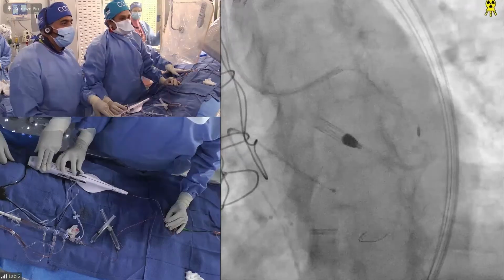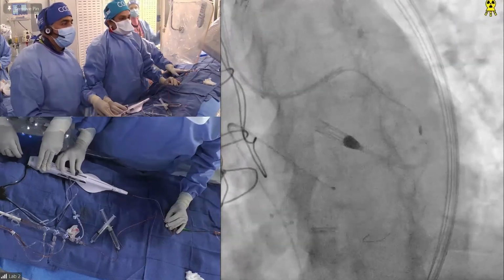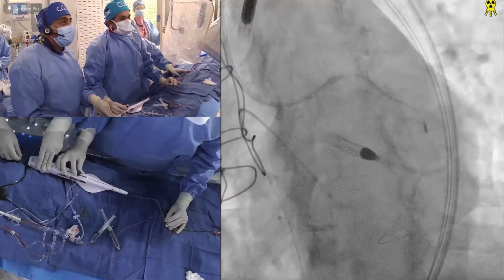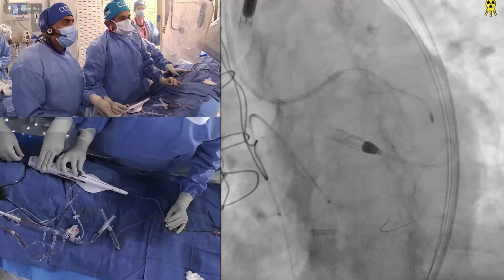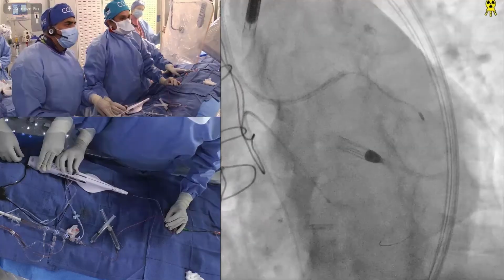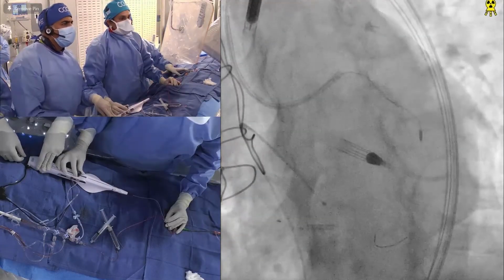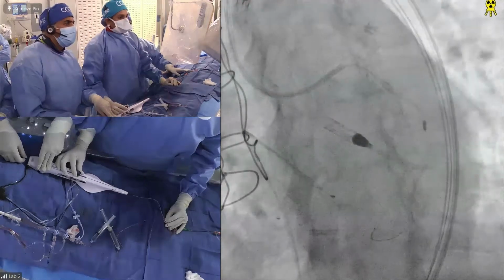Yeah, for sure. You're really happy that you have the Impella in place, guys. I don't know that anyone is questioning that choice. Anyone on the panel would do this without support?